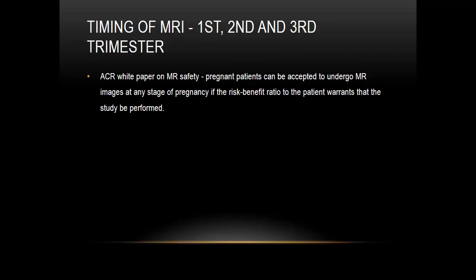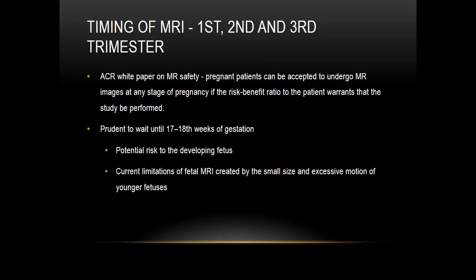So what does the ACR say? The ACR says that pregnant patients can undergo MRI at any stage of pregnancy if you look at the risk-benefit ratio to the patient, and if that warrants that an exam be done. So you can do an exam in patients who are in the first trimester as well.